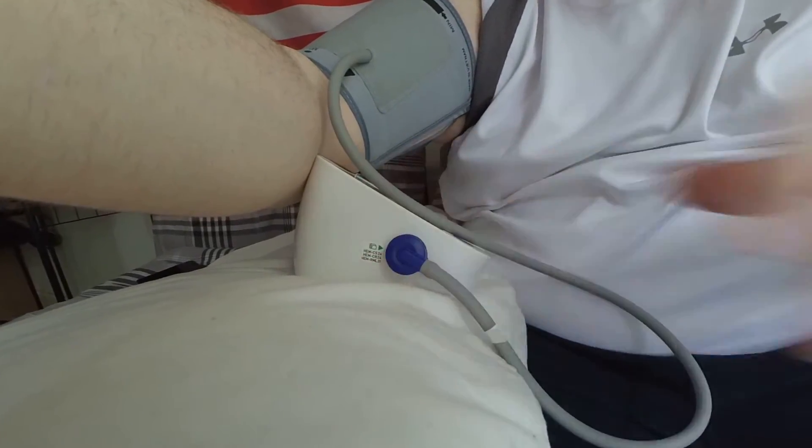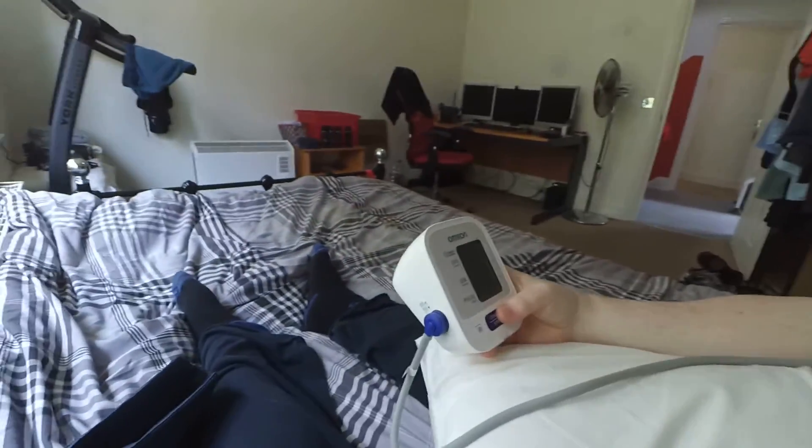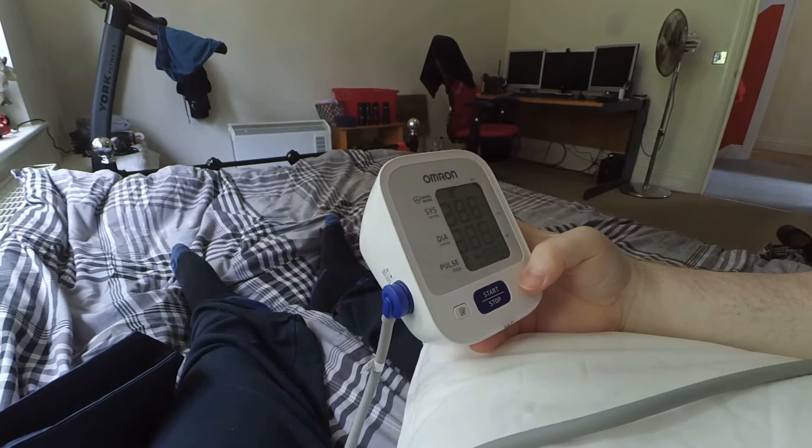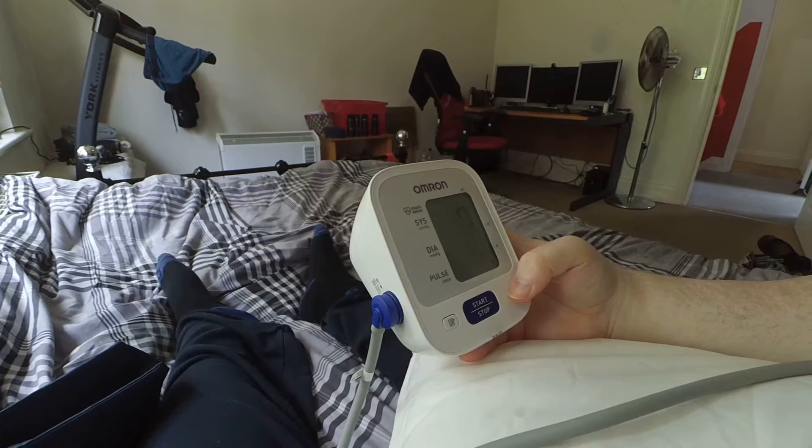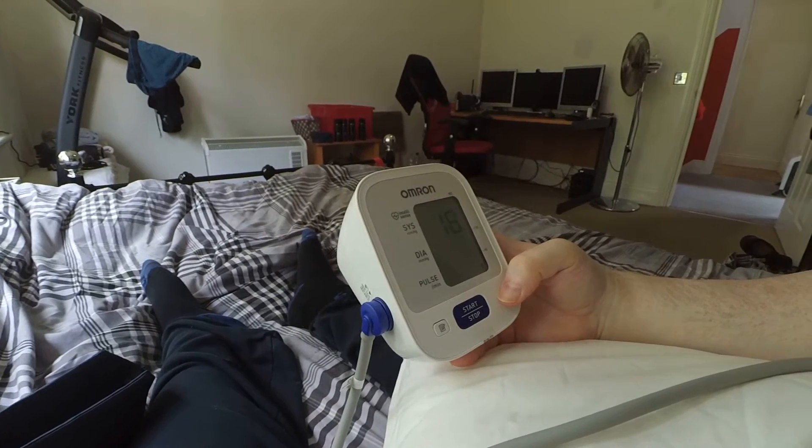Now that we have the armband attached, we take the connector and plug it into the side of the Omron M2. We're basically ready to begin. I should note that you are supposed to have sat down for 10 minutes or so before doing one of these, otherwise you might get an elevated reading — but anyway, who has time for that? So let's just proceed and press the start button.